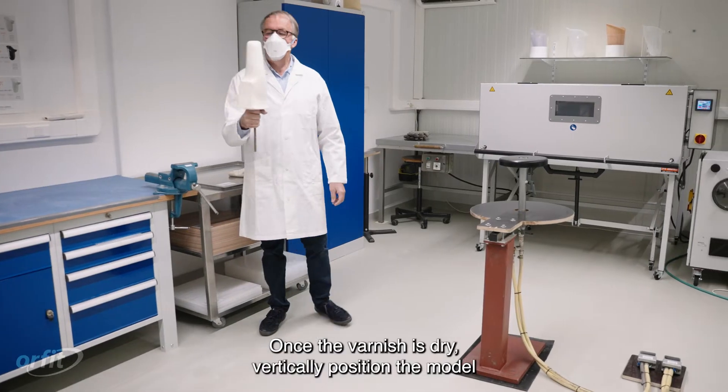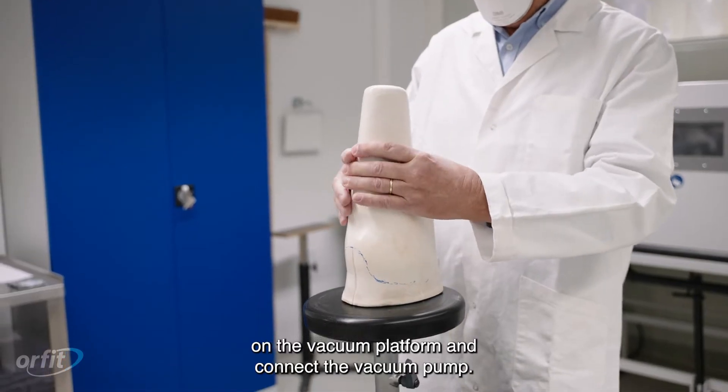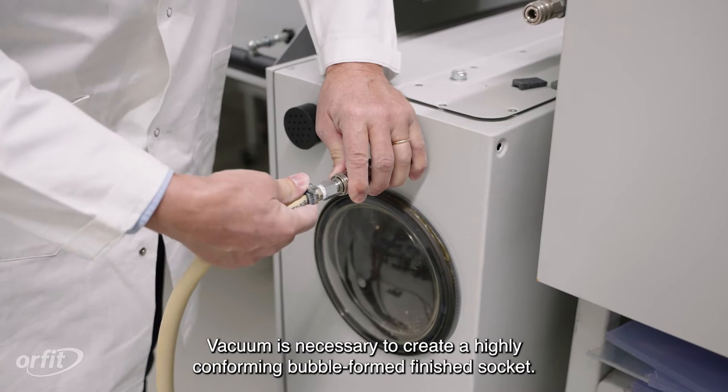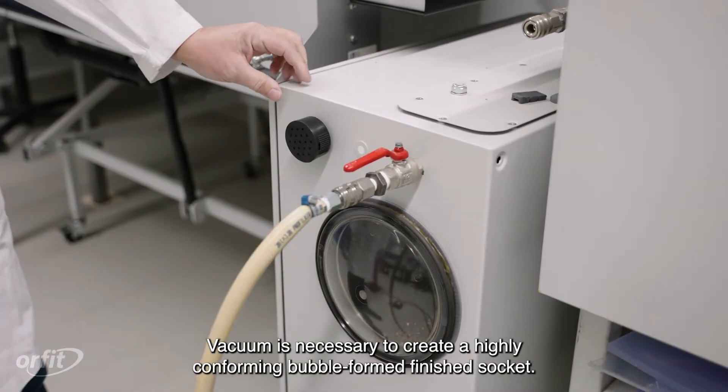Once the varnish is dry, vertically position the model on the vacuum platform and connect the vacuum pump. Vacuum is necessary to create a highly conforming, bubble-formed finished socket.